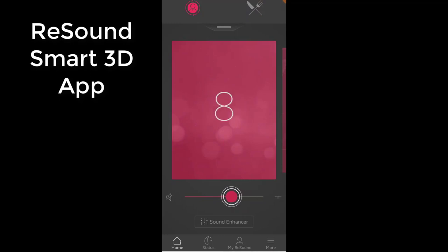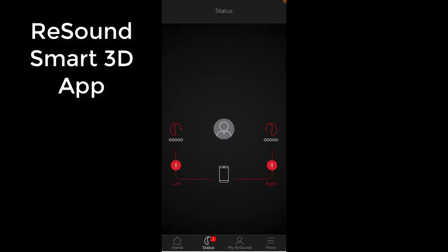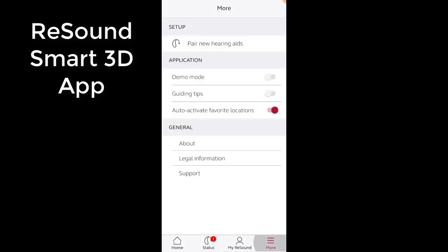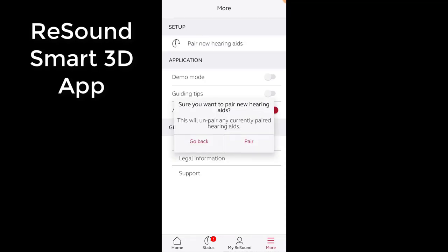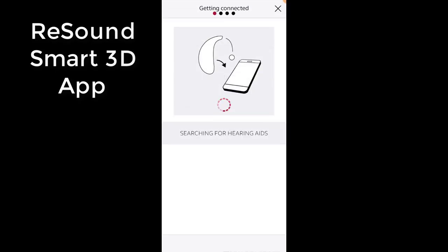The Smart3D app is still one of the better apps in the hearing aid industry, but I noticed some issues establishing and maintaining a solid connection to my devices. And if you're upgrading from a Lynx device that used the Smart3D app to the ReSound One, just completely delete the app and start over — I promise this will save you a ton of time.